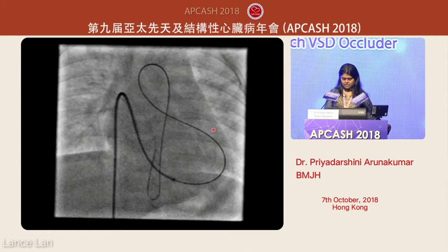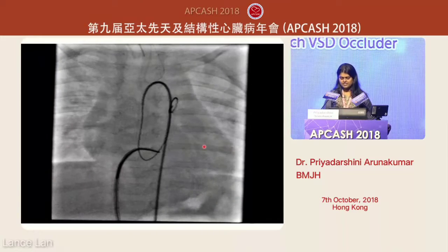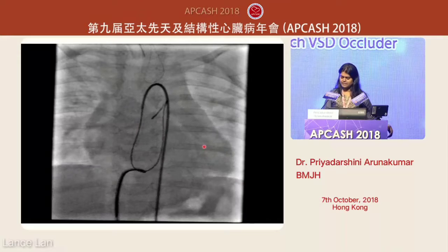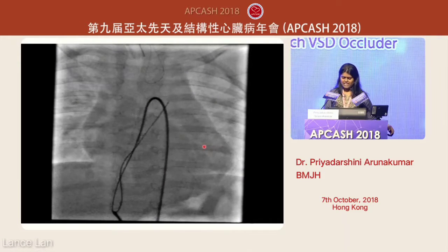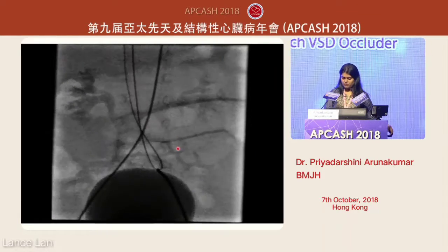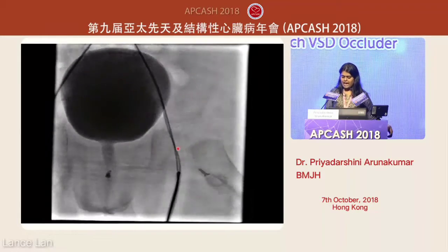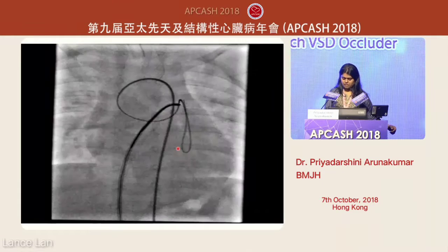So we gave up this venous side approach, and again tried crossing the arterial side with some kind of skepticism, because I told you it's going to be a small baby in whom we're going to have a pulse loss if we went ahead, but it was again not successful, and so we finally went on to this, where we did an arteriovenous railroad and put the wire in the branch pulmonary artery and snared it through the contralateral venous side.